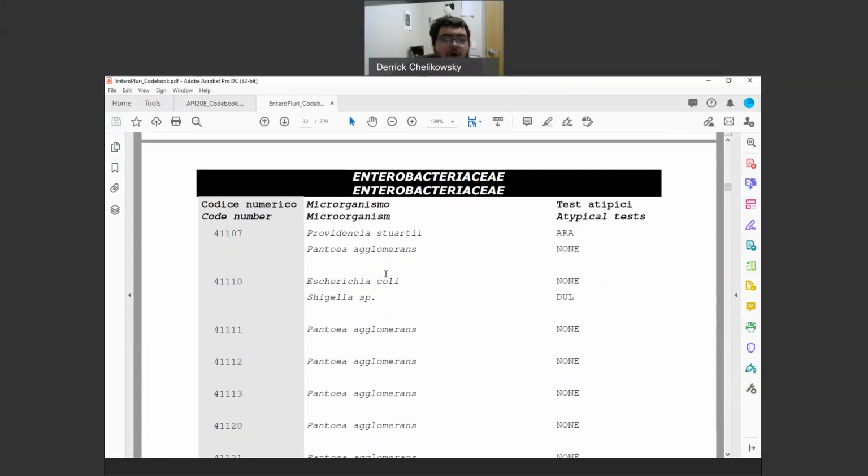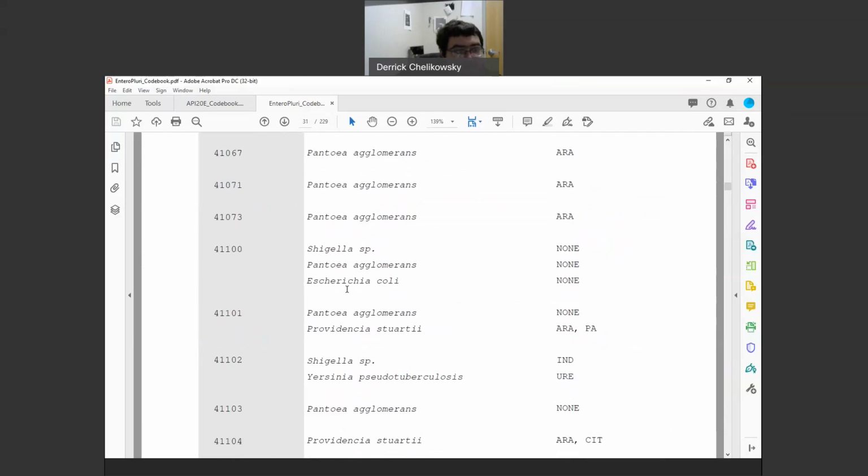All right, 411. 00 is right here. So now, what do we have? We might have an E. coli, we might have a Pantoea, or we might have a Shigella.